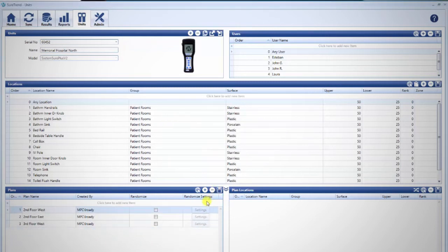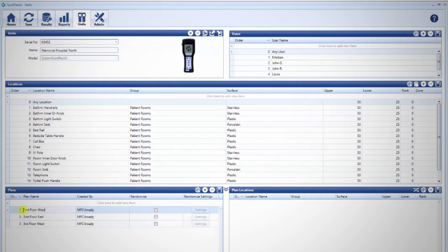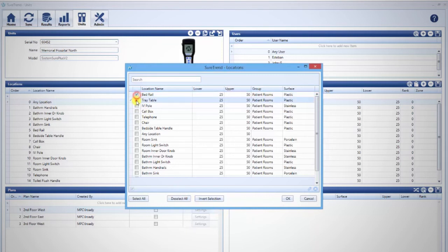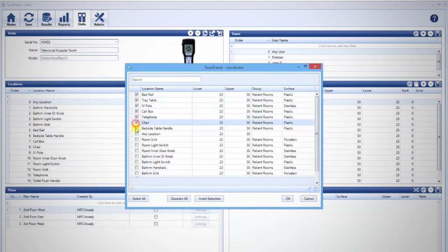Now you need to add test locations to the plan. First, select the desired plan you want to edit. In the pane to the right, Plan Locations, select the globe icon on the top right. This will open a window that will let you select locations for this test plan from the locations on this unit. Once you've checked the locations you wish to add to this plan, click OK.